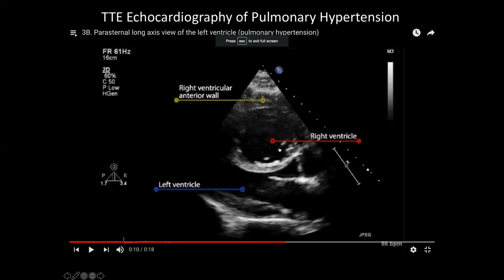And so it's hard to get good echo pictures of the whole volume. So normally for right ventricular anatomy and function, it's better to use magnetic resonance or CT, but nobody uses CT. So you would go to MR usually, or MRI.